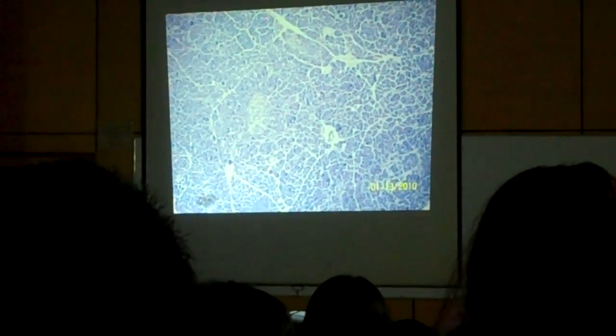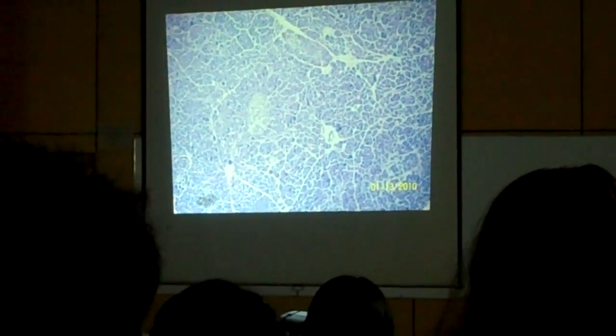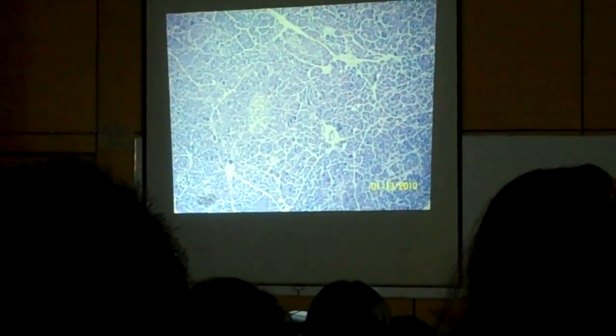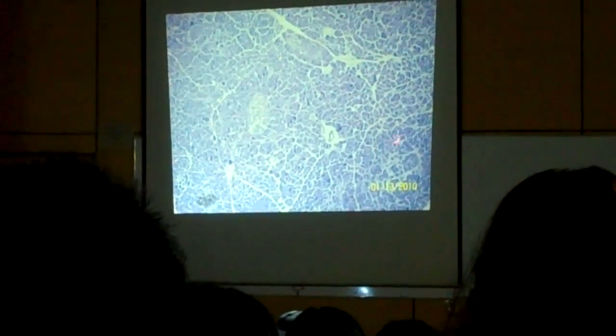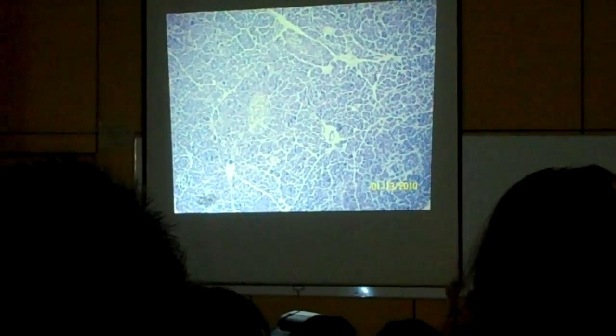Where are the islets concentrated, on what part of the pancreas? In the tail. So either we will ask you to identify the whole organ or identify the structure. Of course, we will no longer be concerned with the surrounding parenchyma, only with the islet.